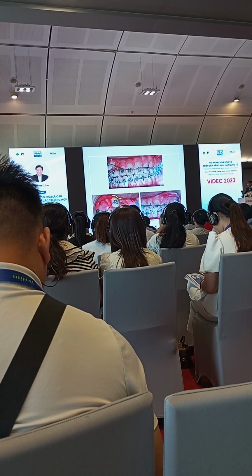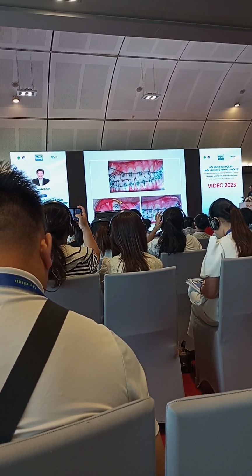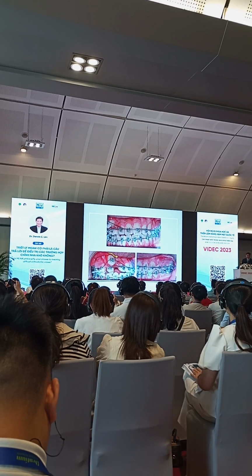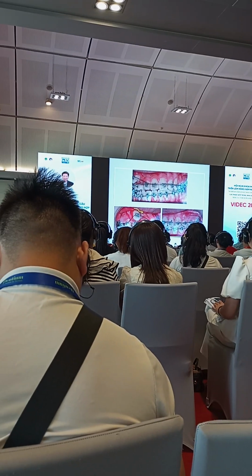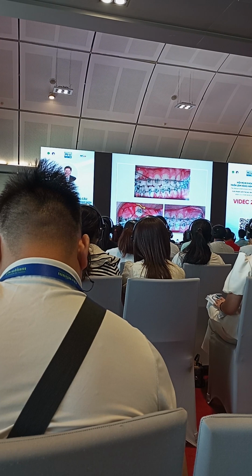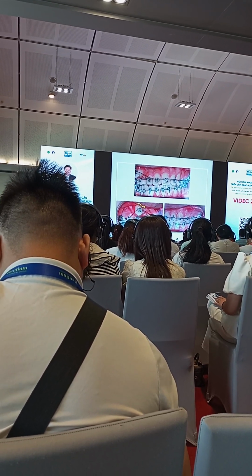So the canine is now on top of the premolar, okay. So we started to now open the space. Okay. So I'm just showing you what I did wrong, okay? I made a mistake for this particular case because this is the case that I treated when I just finished my schooling, okay? I just graduated and I'm just in my early practice.